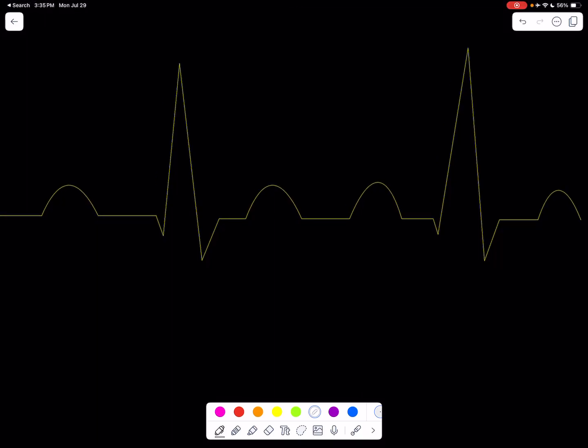Okay, in this video, we're going to be talking about an electrocardiogram, often referred to as an ECG, or if you're German, EKG. And I like the way EKG sounds, so oftentimes I use that. Okay, so with this video, we're going to go through a bunch of waves, segments, and intervals. We're going to start off, and I'm going to highlight these in red. We're going to do waves.